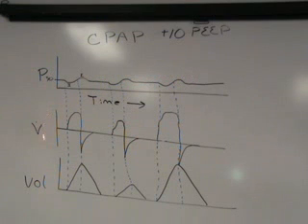If we take a look at the flow pattern during these spontaneous breaths, you see that we have a sinusoidal flow pattern on inspiration. Now I've drawn these purposefully so that they're not perfectly linear, because here the person is just spontaneously breathing at this elevated baseline. We normally will see an inspiratory flow pattern be sinusoidal. Okay, we start off at 0, flow will increase, and then flow will decrease back to 0 until the end of the breath. So here we have an inspiratory flow pattern that correlates with inspiration on the pressure time scalar, another inspiratory flow pattern, and then a third inspiratory flow pattern.